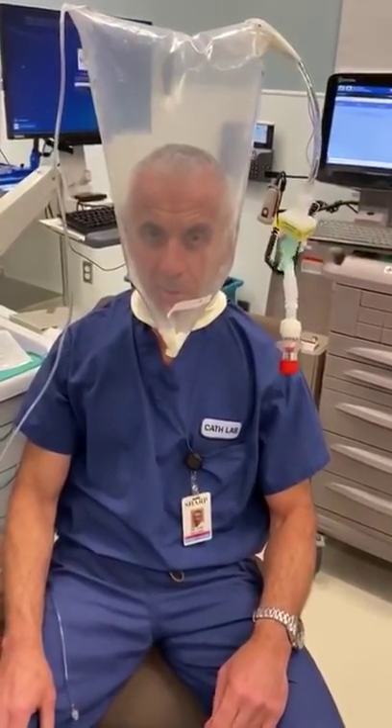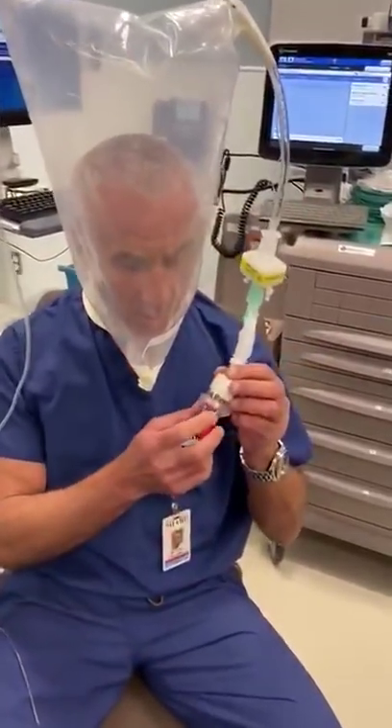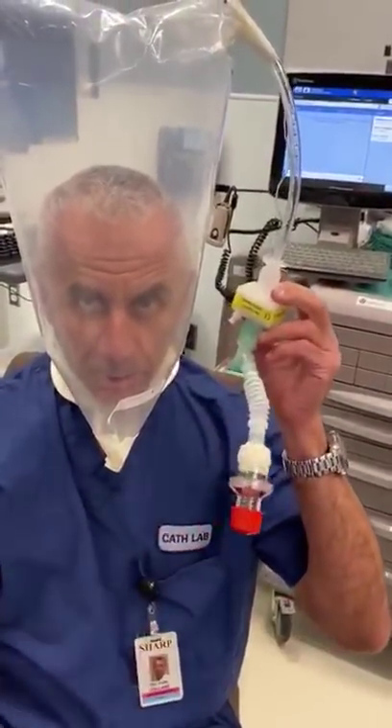I would like to demonstrate how it's possible to create an oxygen tent with continuous positive airway pressure using just a ziplock bag, a PEEP valve from the Ambu bag, and a HEPA filter.